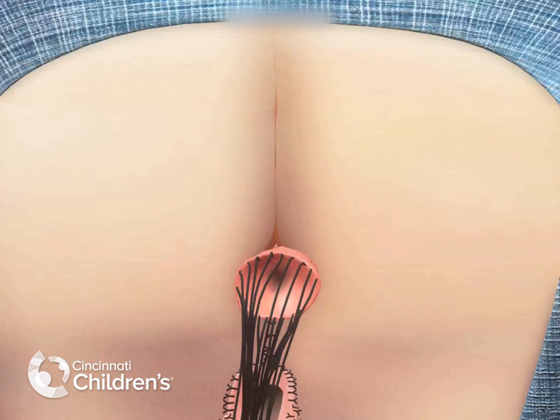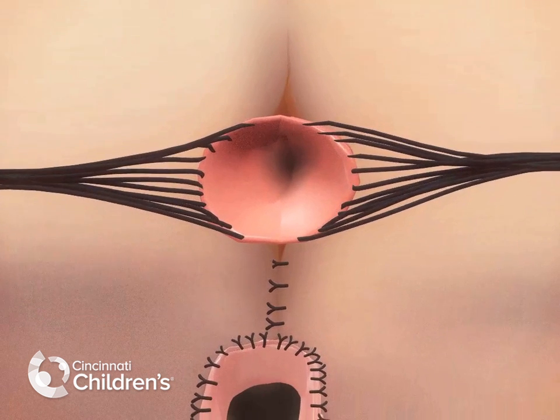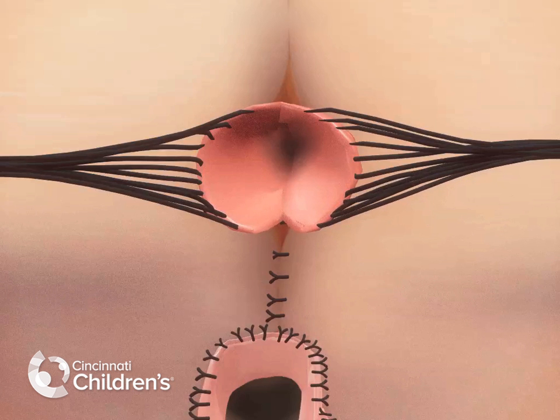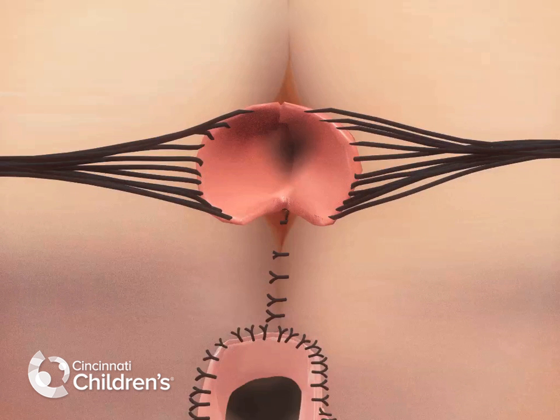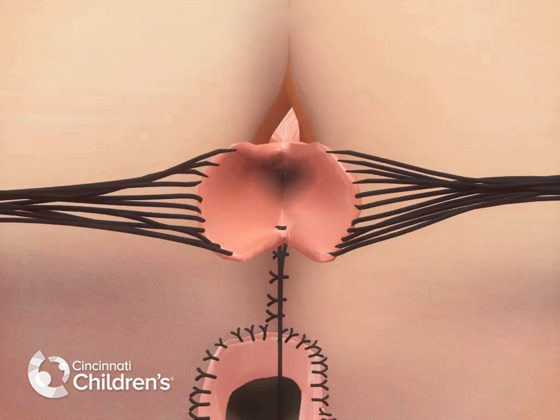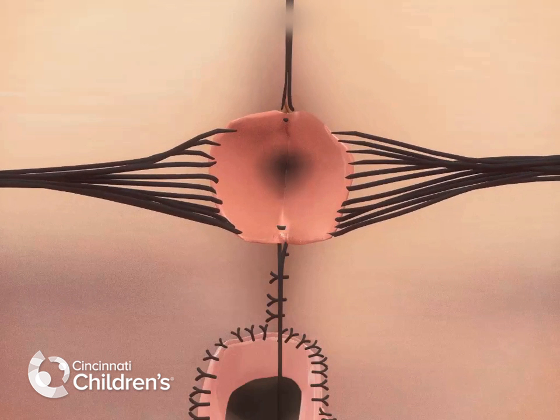The anoplasty is now performed. The rectum is first divided in the midline down to the level of the skin. Sutures are placed in a U-type fashion from the skin through the bowel and back out of the skin at the 12 and 6 o'clock positions to anchor the rectum. The excess rectal tissue is then excised.